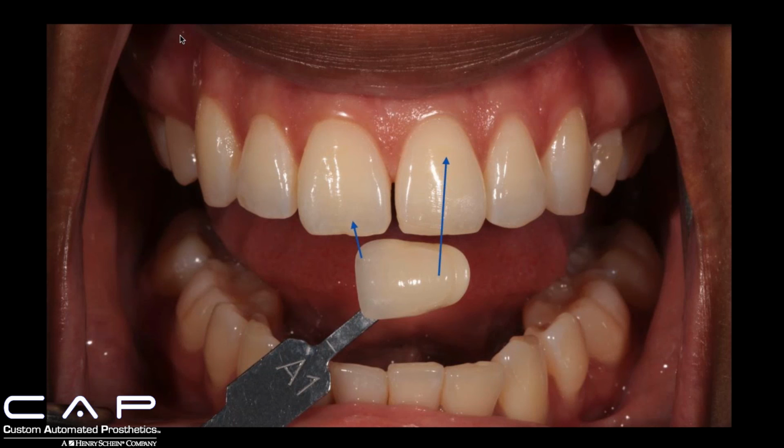The other reason, and the most important reason for me, is the distance between the incisal edge of the shade tab and the incisal edge of the adjacent tooth or the tooth that you're going to be matching. And then the shortest distance between the body, the most chromatic colored portion of the tooth, and the chromatic body of the shade tab.